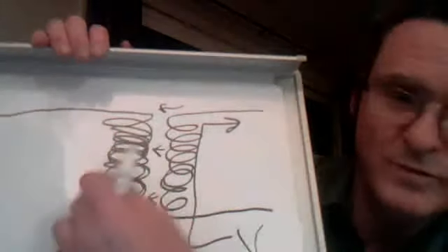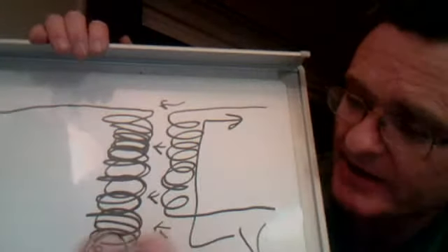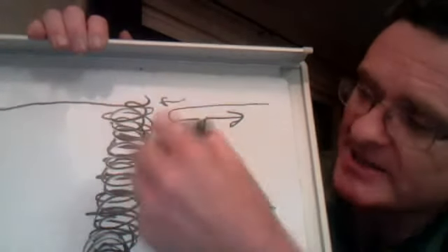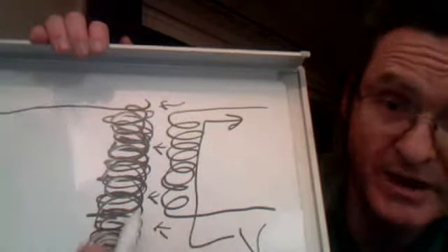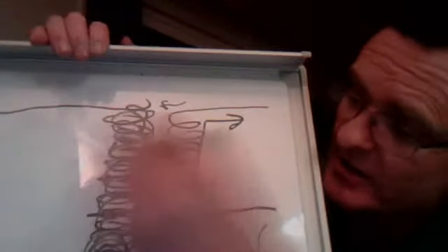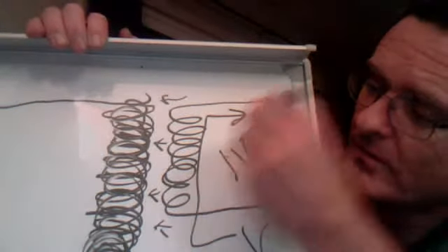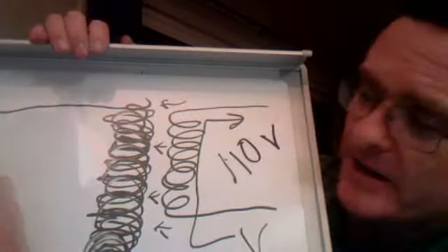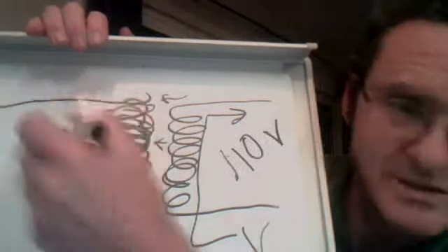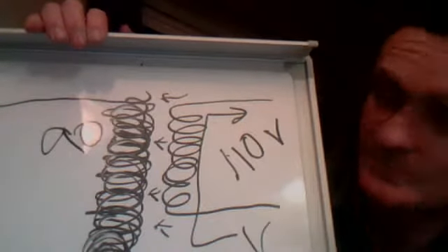And if we put way more coils of wire onto the secondary coil than we did the first, you will in essence raise the voltage by the same ratio of turns that you've put into the increase. So we can take 110 volt power out of the wall and actually get it up to the 90 kilovolts that's going to be used to run the dental x-ray machine.